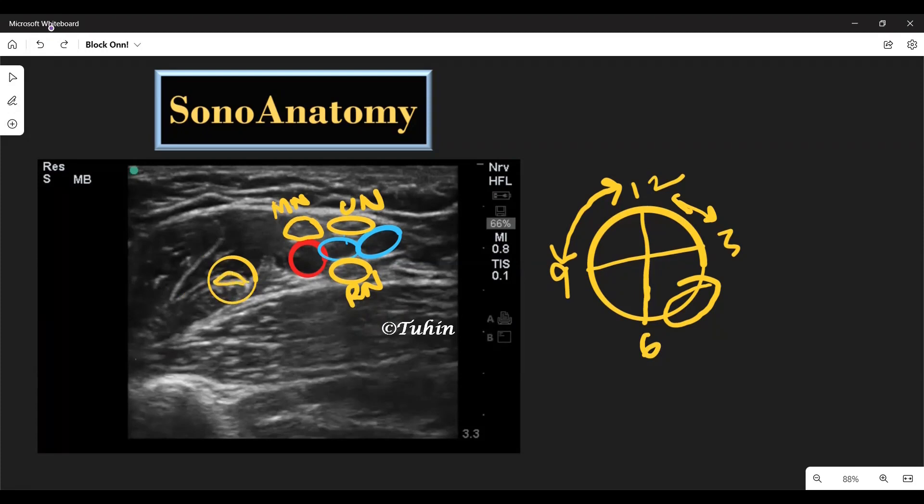Other than the neurovascular bundle, we can also identify the double-layered conjoined tendon formed by the tendons of the latissimus dorsi muscle and the teres major muscle. This is visualized at the proximal level, and if you go distally along the arm, you will get the triceps muscle instead of latissimus dorsi or teres major. Here, you can also see part of the humerus.